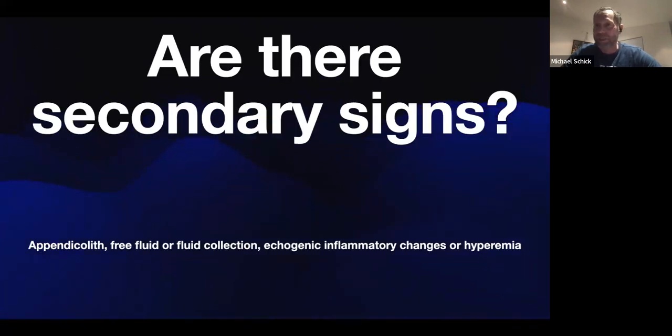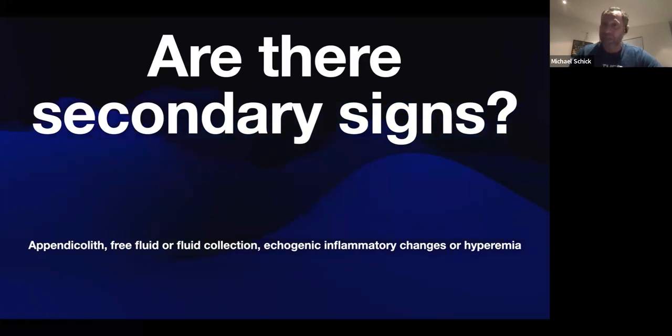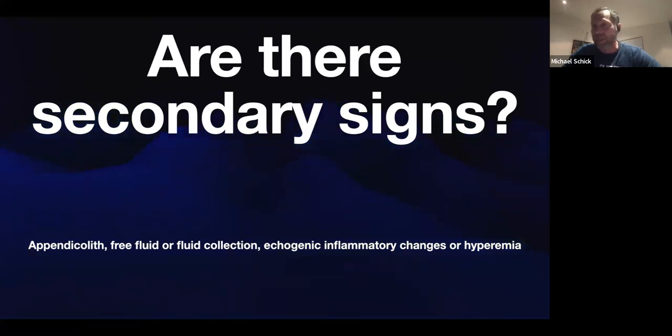The next step is, are there secondary signs of appendicitis? Now, I generally don't look for these myself. I have, but I would prefer a sonographer, someone who does a lot of these, or it might be a radiologist in your setting, to do this pediatric scan and look for secondary signs. So if I've looked myself and I can't find the appendix, I'm going to try to get an official ultrasound or a radiology ultrasound done so they can really evaluate for secondary signs. But if I had no one else, then I would do this myself.